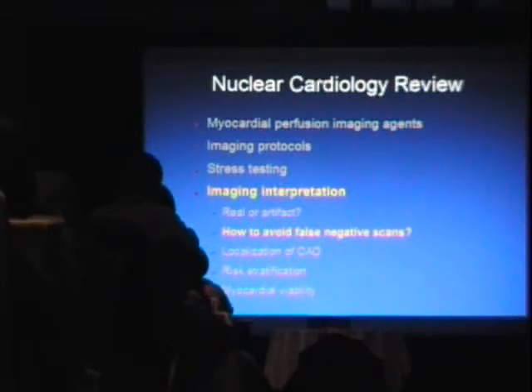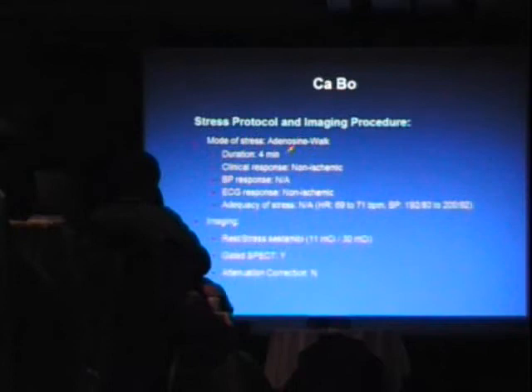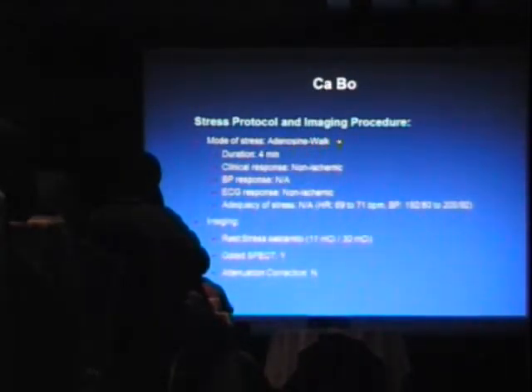Now, how do we avoid false negative scans? Again, these are tricky things to deal with. This is a patient with coronary disease who comes for dyspnea evaluation and has an adenosine test, to which we added a little bit of exercise in combination with the adenosine.